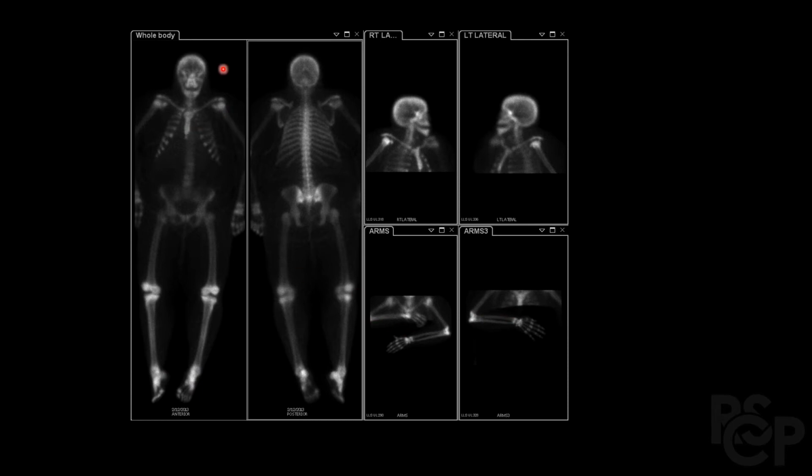So this is actually indicative of metabolic disease, and there are certain signs that are very specific to a metabolic disease. For example, the skull with the diffuse uptake, which is present throughout the skull. This is different than metastatic disease, where we saw focal areas of increased uptake. And then working our way downwards, we see the sternum.